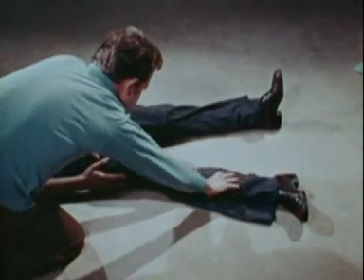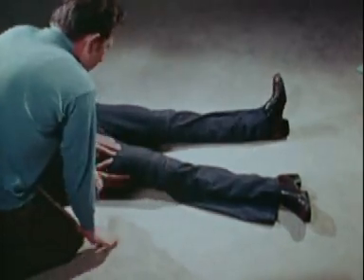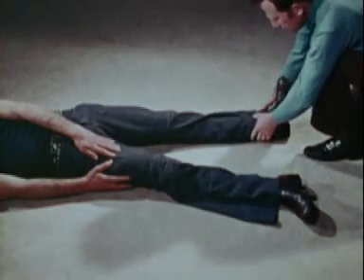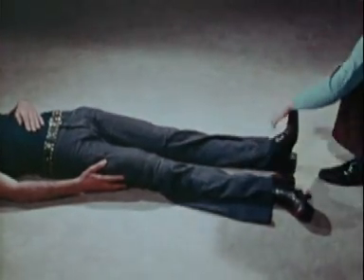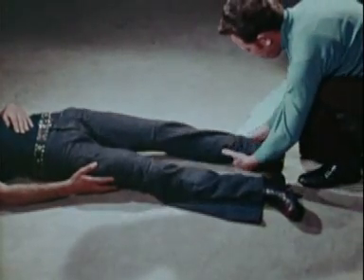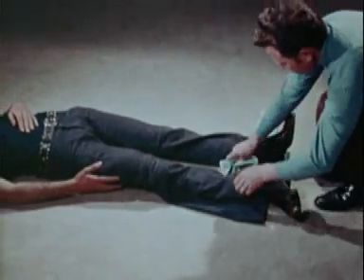Make sure that the fractured limb has not received any other injury and if the fracture is not an open one, gently bring the uninjured limb into alignment with the injured one. Slip a wide bandage under the ankles without disturbing the injured limb.